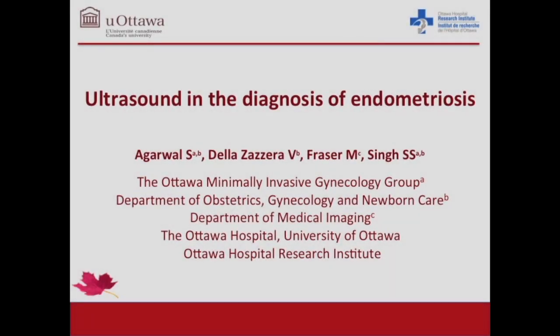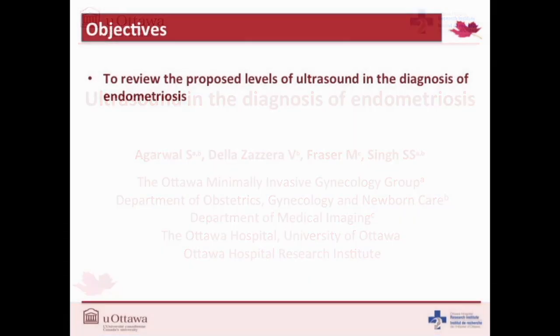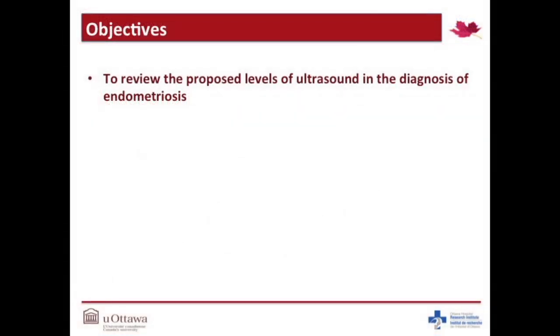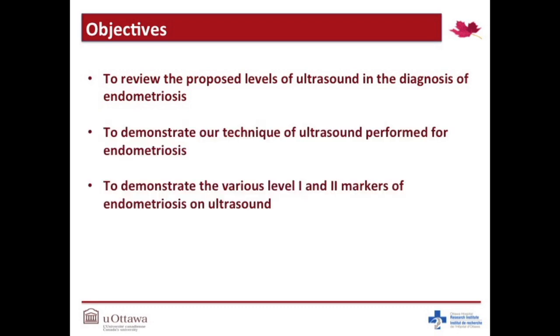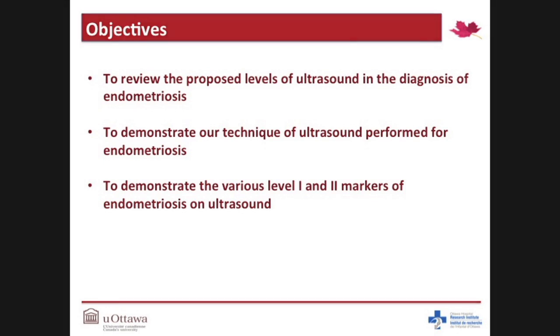The Ottawa Minimally Invasive Gynecology Group, University of Ottawa presents Ultrasound in the Diagnosis of Endometriosis. The objectives of the video are to review the proposed levels of ultrasound in the diagnosis of endometriosis, to demonstrate our technique of ultrasound specifically performed for endometriosis, as well as to demonstrate the various level 1 and level 2 markers for diagnosis on ultrasound.